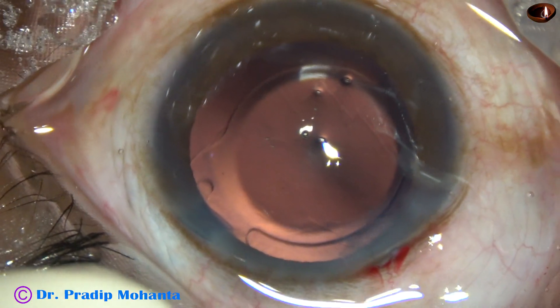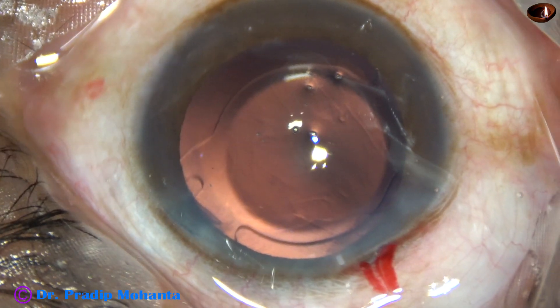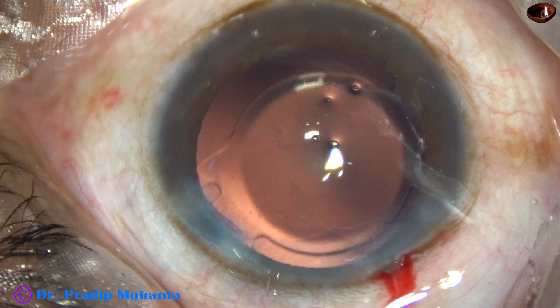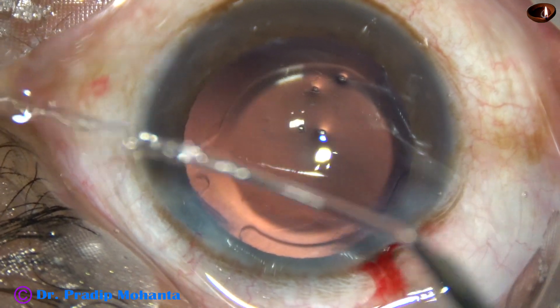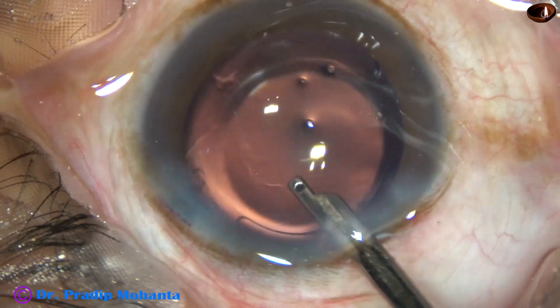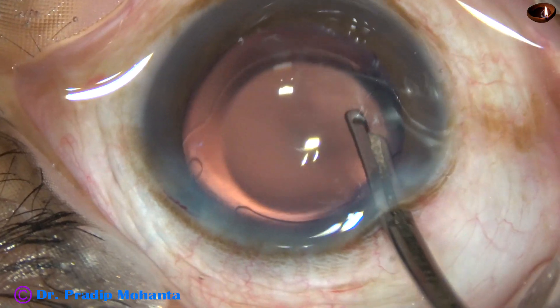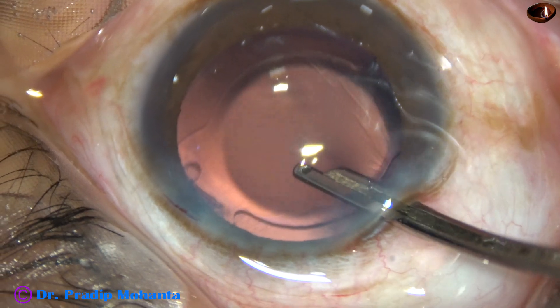The side port is to be closed. This is a bit of moxifloxacin. Corneal stroma on either side of the side port is hydrated, and the side port gets closed. Then a final lavage of the anterior chamber with BSS. As I direct a gentle stream of fluid towards the corneal endothelium, a lot of visco that sticks to the corneal endothelium comes out. After this final lavage, the anterior chamber is nicely formed.